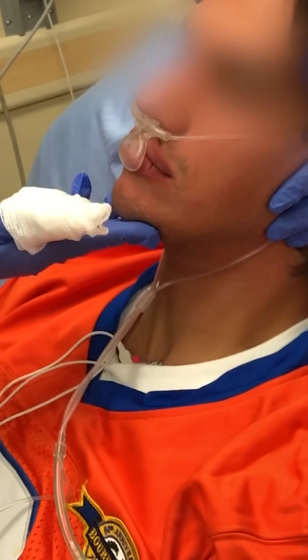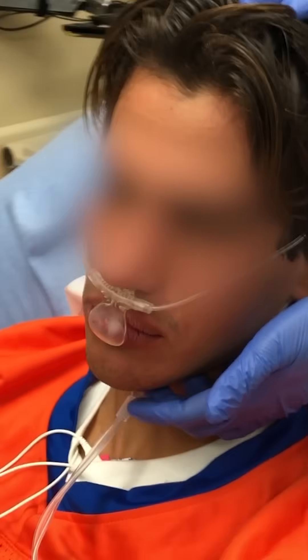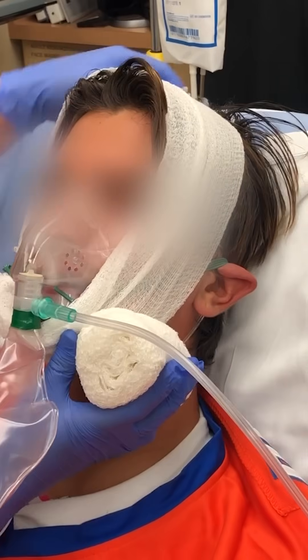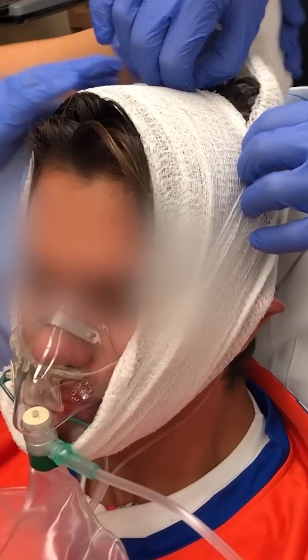In this case there wasn't a big satisfying clunk, but Dr. Falsgraf, who performed the procedure, said that it slid in nice and smooth. While the patient was waking up, we put him in a modified Barton bandage to give him jaw support, really to prevent him from yawning and dislocating again. He definitely needs to follow up with OMFS.